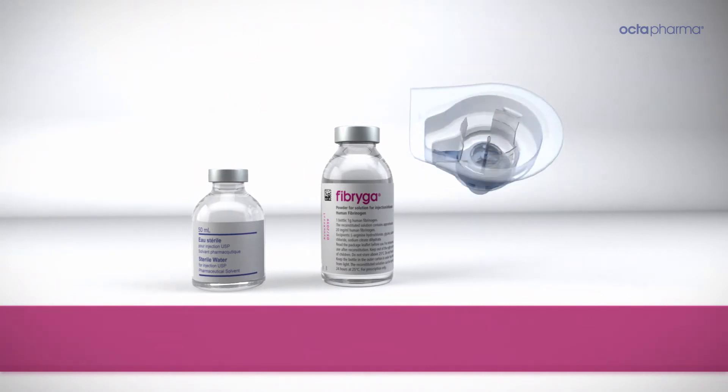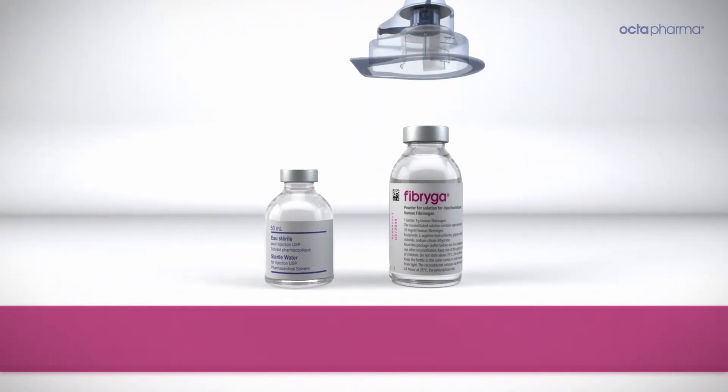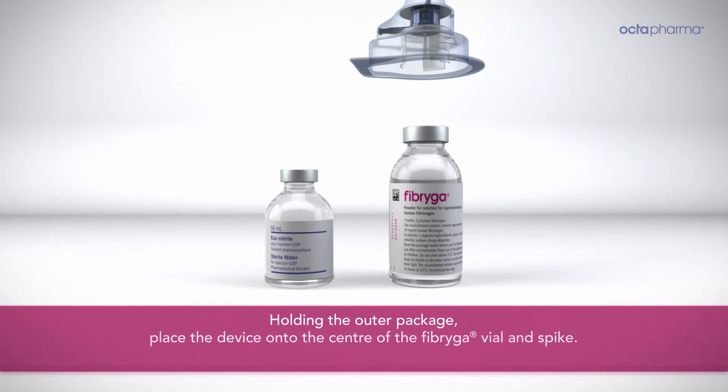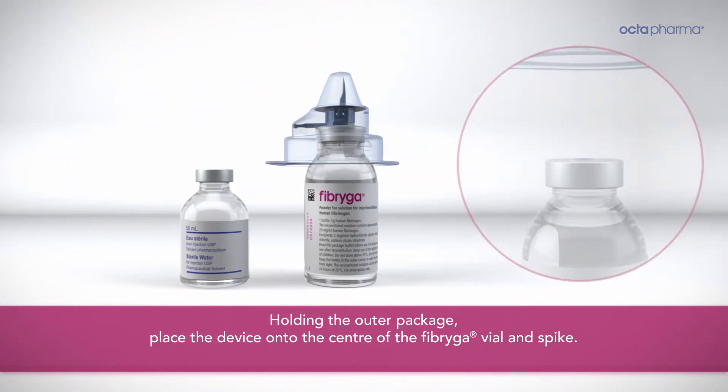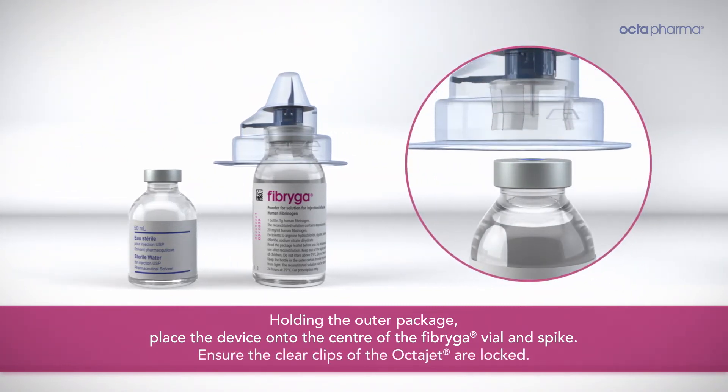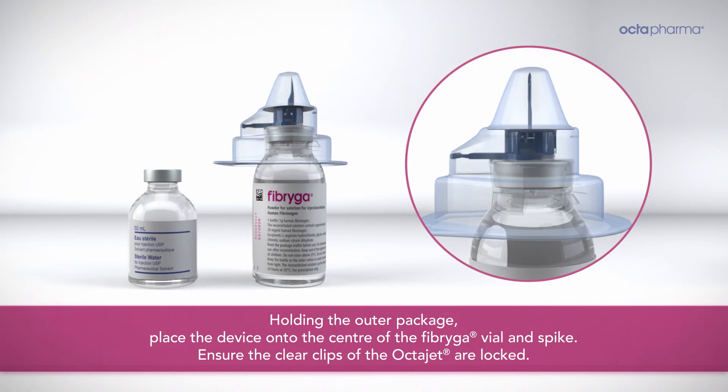Take the OctoJet in its outer package and invert it over the Fibriga vial. Holding the outer package, place the device onto the center of the Fibriga vial and spike. Ensure the clear clips of the OctoJet are locked onto the neck of the Fibriga vial.